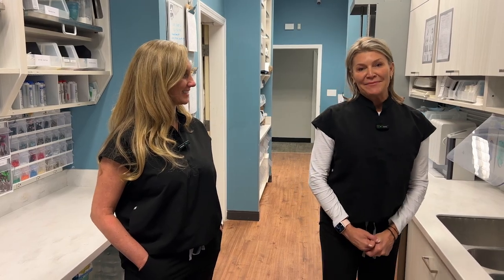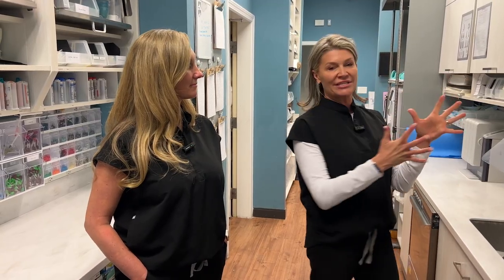Hi everybody. Angie Bachman here again from Design Ergonomics. I am here with Heather Hurley from Sala Family Dentistry. She has come all the way to Massachusetts from Reno, Nevada to check out our new SteriCenter.